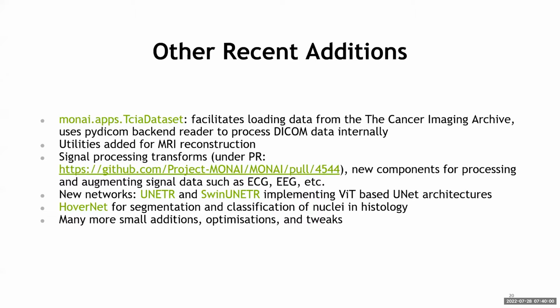HoverNet was added recently, as well as a network for doing segmentation and classification in histology. So again, moving into other imaging areas away from just CT and MR, which has primarily been our focus, certainly has been my focus as for research as well.